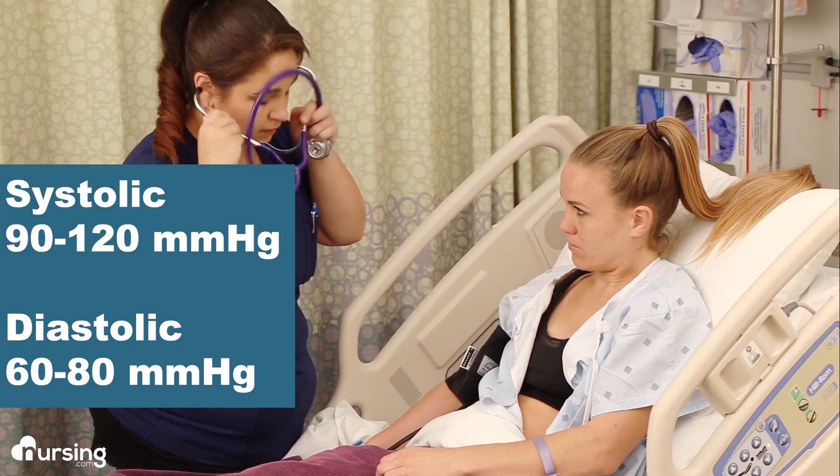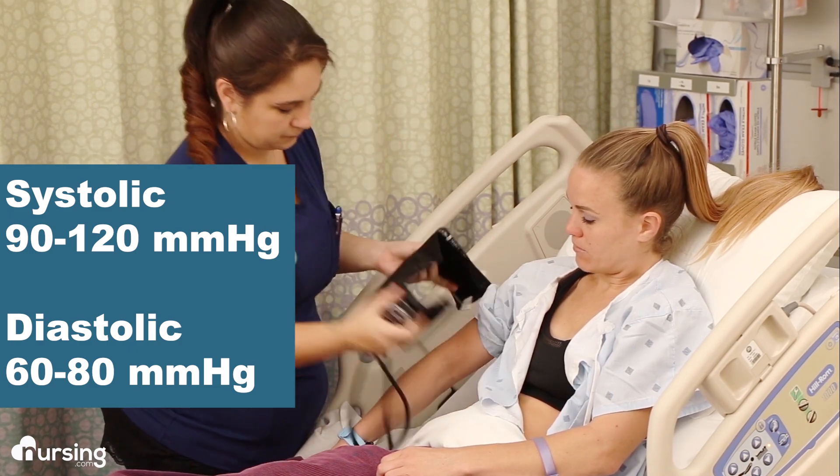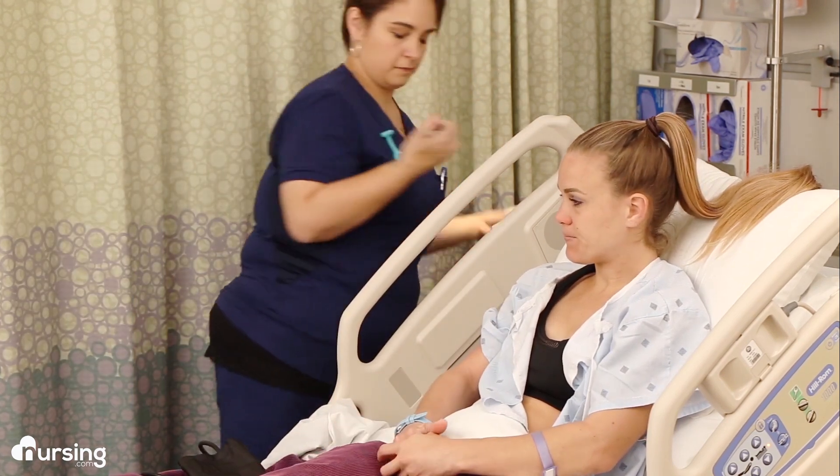Keep deflating until the pulse sound fades and you don't hear it anymore — at that point, it is your diastolic pressure. Just be careful that you're not just watching the needle bounce; it won't be accurate that way. It has to be what you hear.